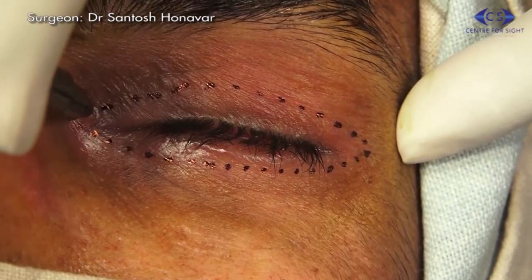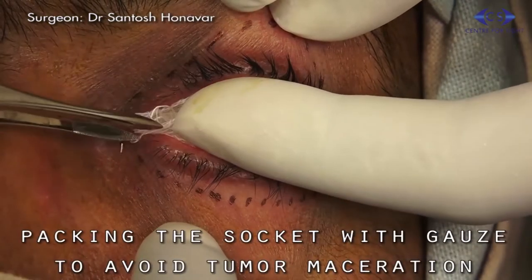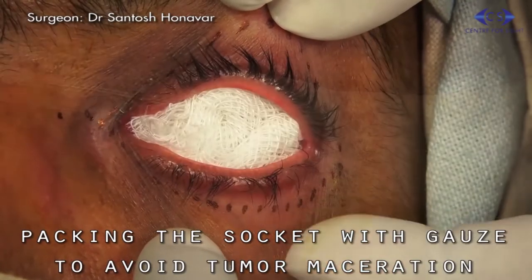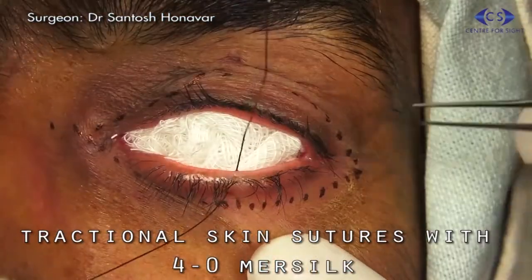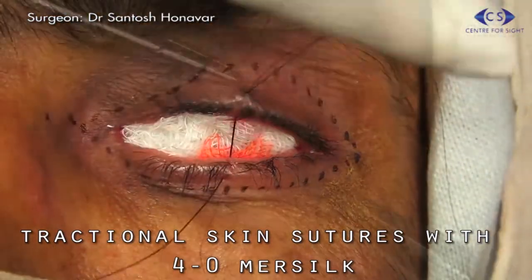A sterile piece of gauze is placed in the conjunctival cul-de-sac in conjunctival tumors, as in our case, to avoid maceration of the tumor.